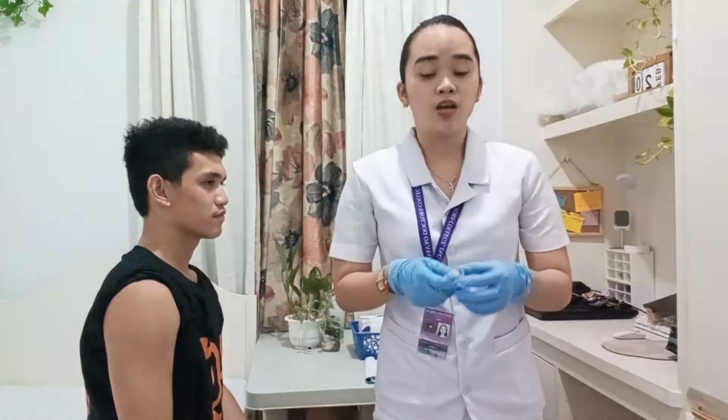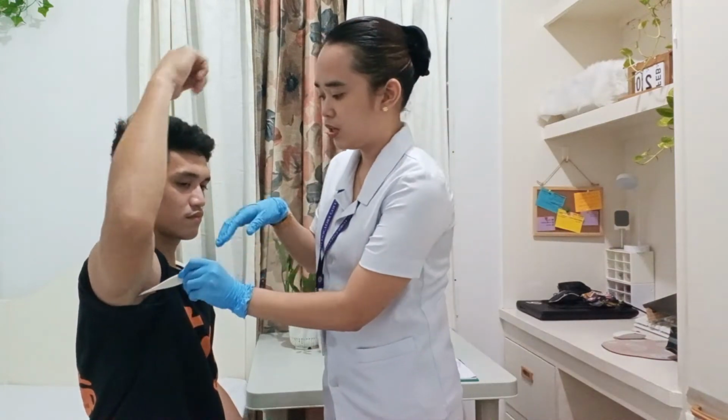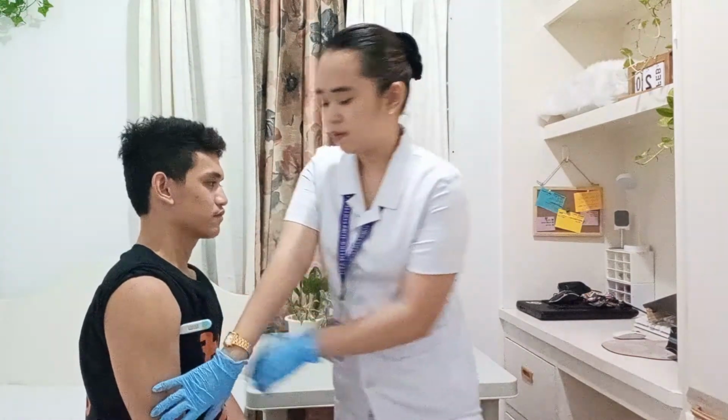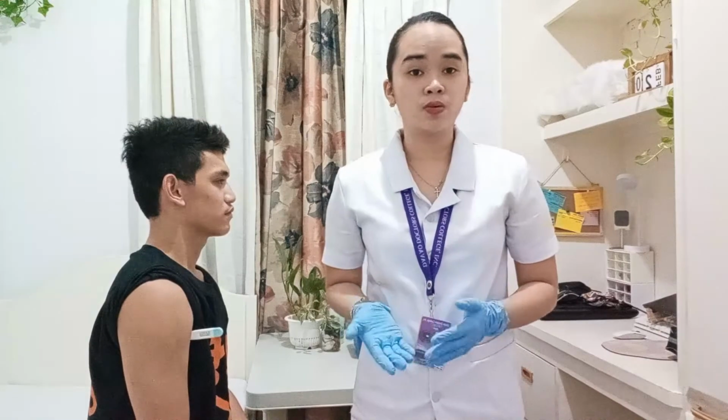Okay, now I'm going to insert the tip of the thermometer to the center of the axilla. Okay, can you lay down your arms, please? Okay, now we're going to turn on the thermometer and we will wait for the appropriate amount of time after the placement. Again, the electronic thermometer will indicate the complete reading through a light or a tone.